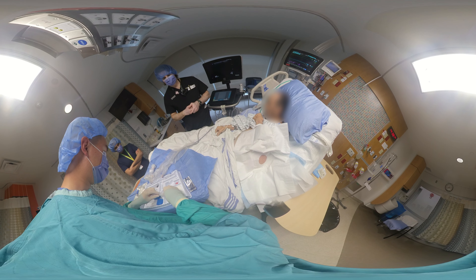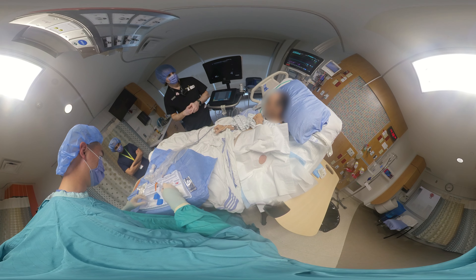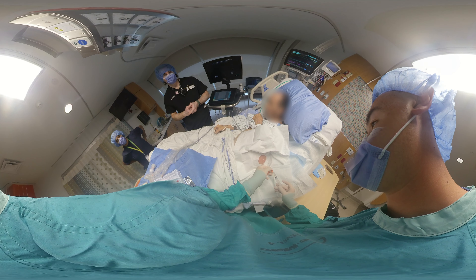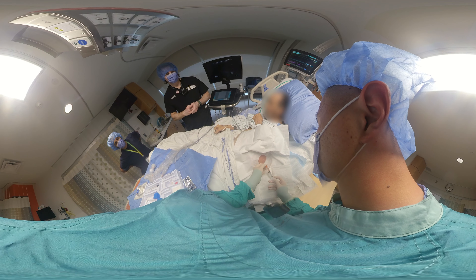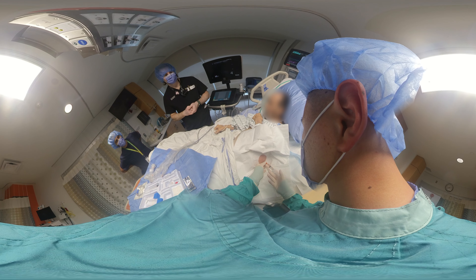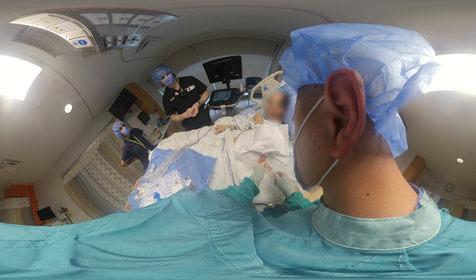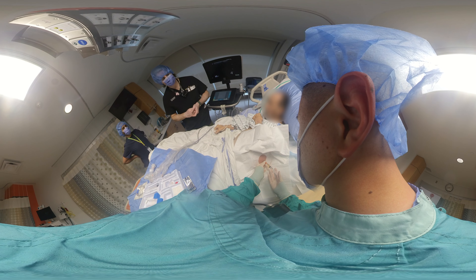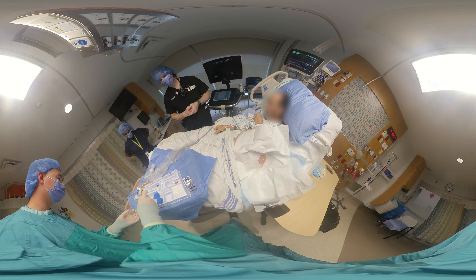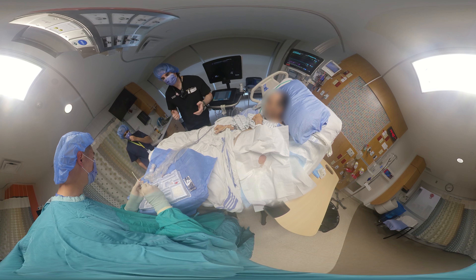We'll switch to a longer needle so we can enter deeper into the abdominal wall to get to the peritoneum. Now we're going to freeze the abdominal wall down to the peritoneum, and as we go, we'll try to get some peritoneal fluid back to confirm we're happy with the track. There's some nice yellow fluid, which means you have a nice clean track to the peritoneal fluid.